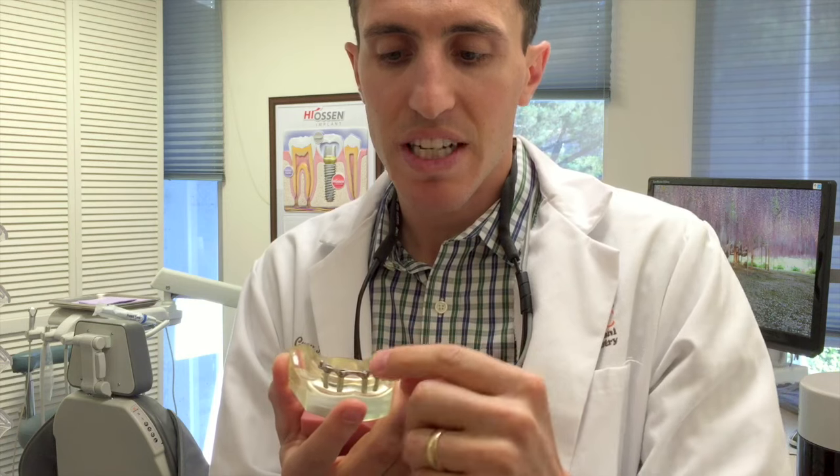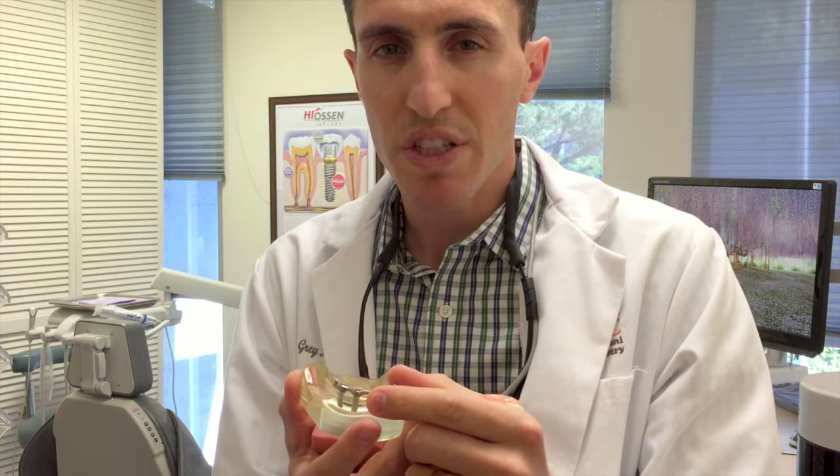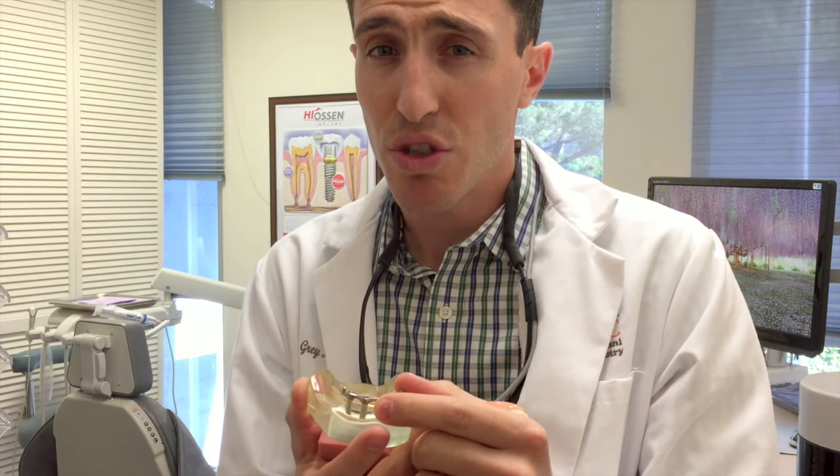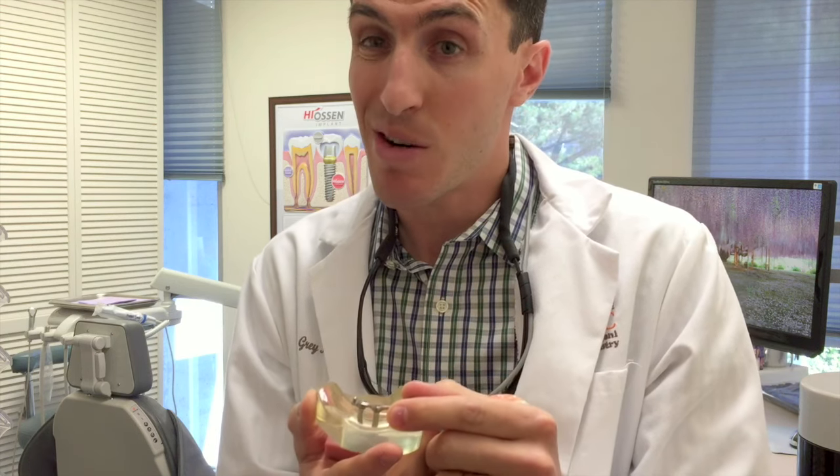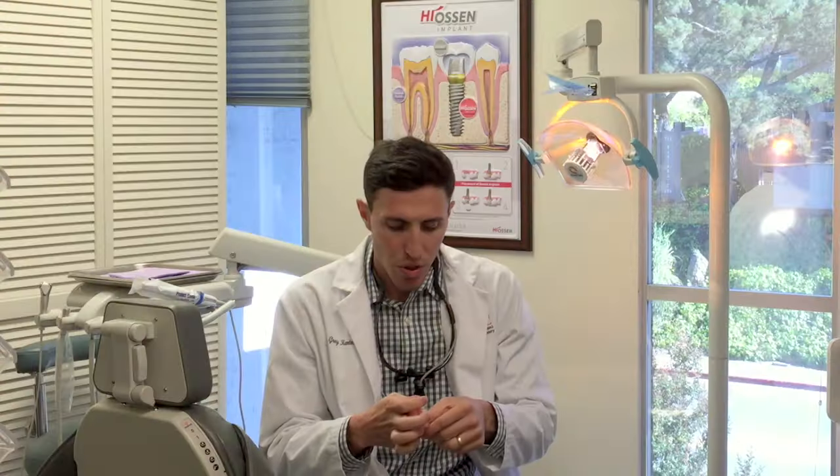A bar wraps around and connects all the implants together, giving you a rigid support, allowing you to chew harder materials and giving you a lot more of your chewing back — almost 60%.